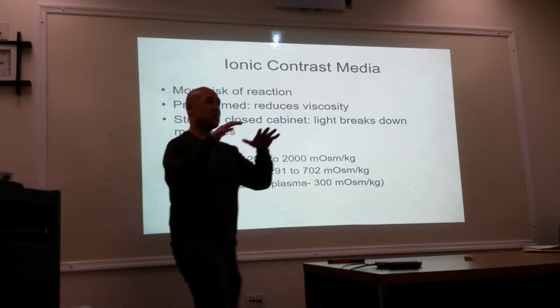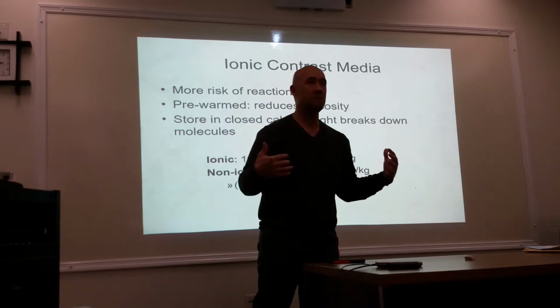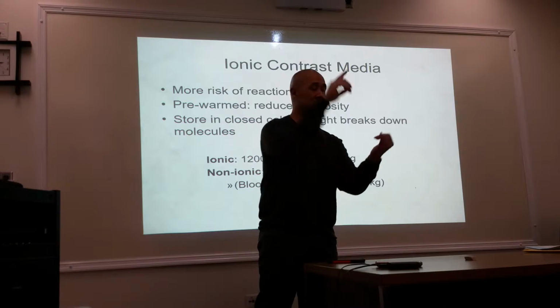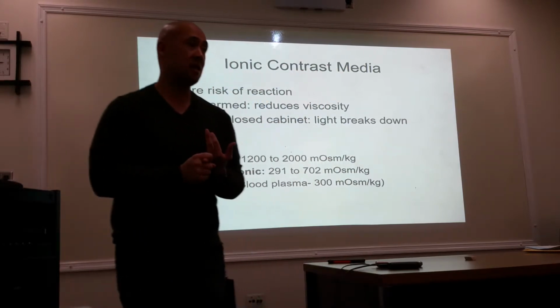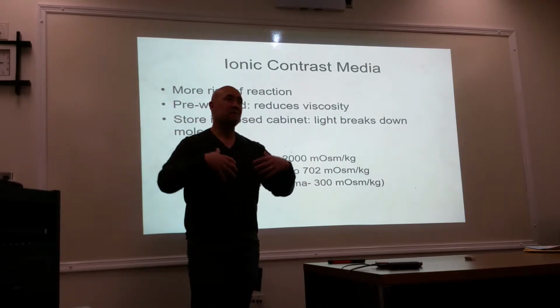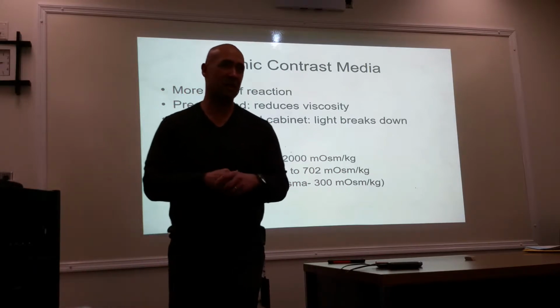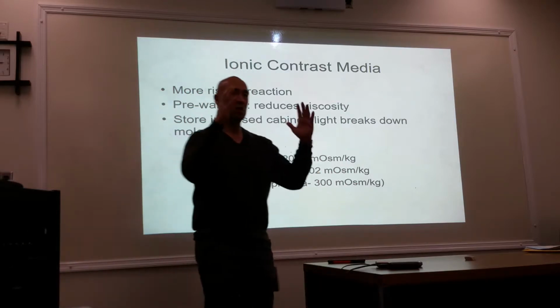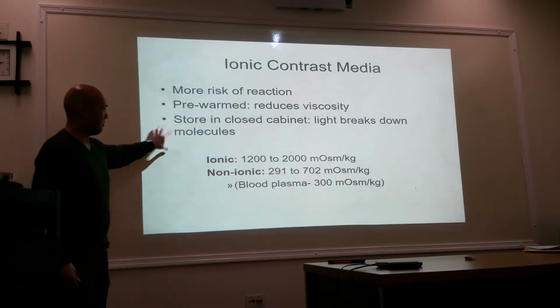The second part of having this box is that it keeps the contrast in a dark environment, because when you leave iodinated contrast under light, whether natural or artificial, for a long period of time, the efficacy of the molecules starts to break down. So it's not going to be as effective when injecting the contrast into the system. They actually start to get a little bit diluted. Okay, so the box keeps it warm. It also keeps it away from the light.